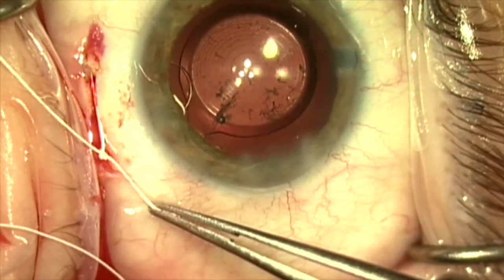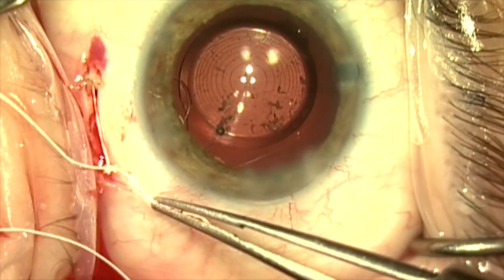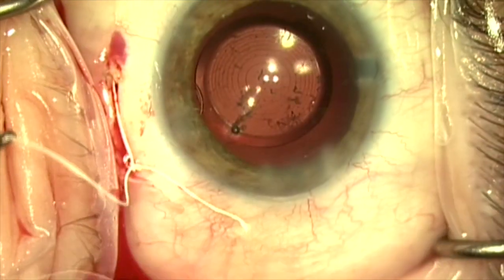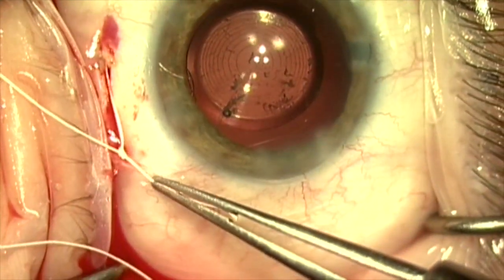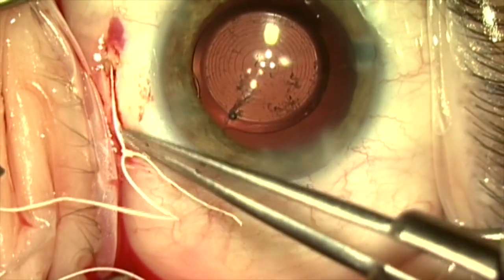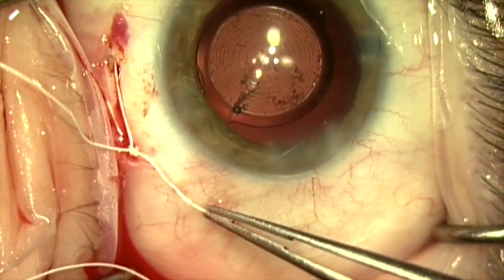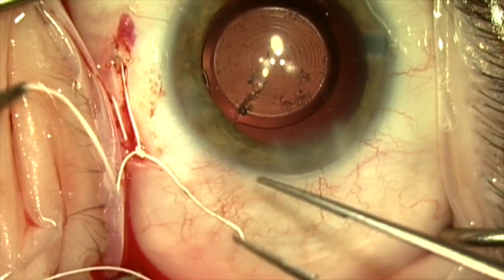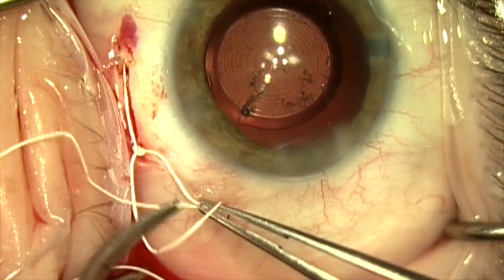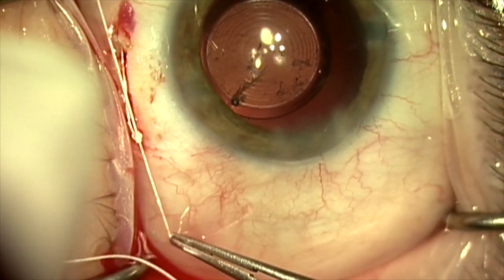Now I'm going to adjust the tension on this Gore-Tex suture using a slipknot. You do not want to make this too tight — if you make it too tight, it will pull the whole capsular bag complex over and dislocate things as the capsular bag contracts, pulling it toward the side where the Gore-Tex suture is. You really just want to make it tight enough to hold everything in place. I adjust it to the tension I want and then lock it in place.